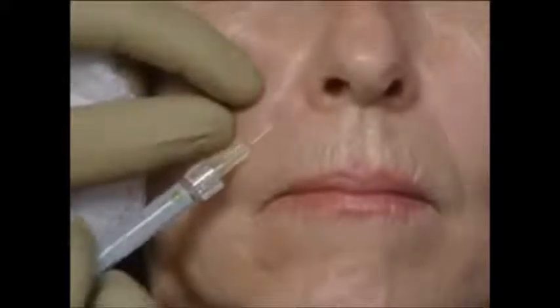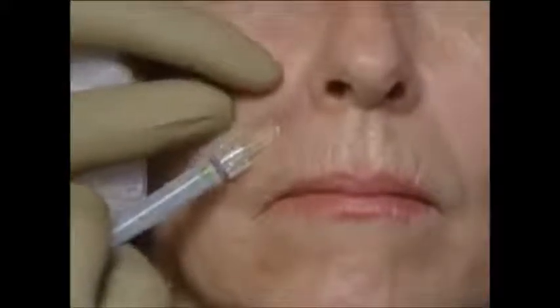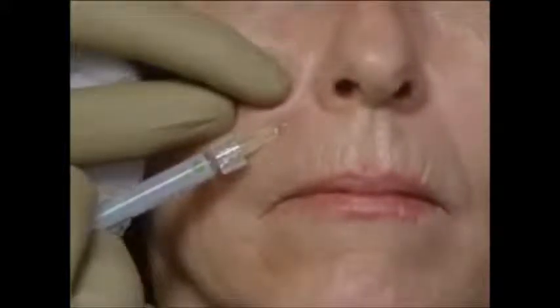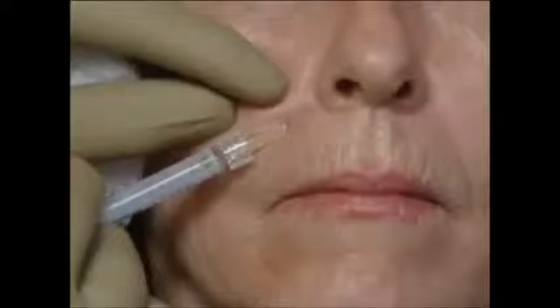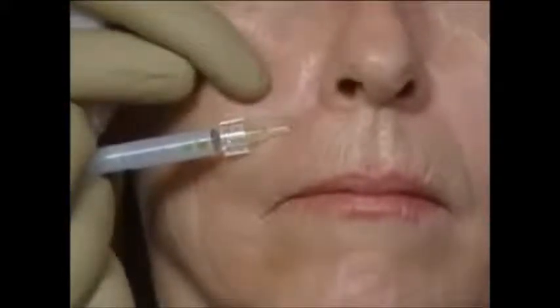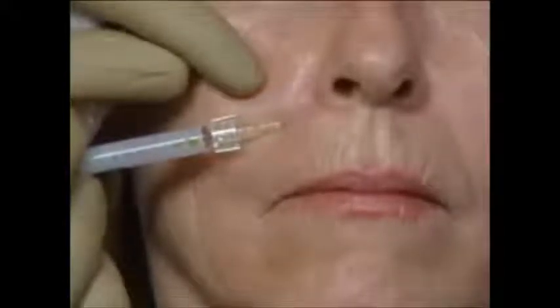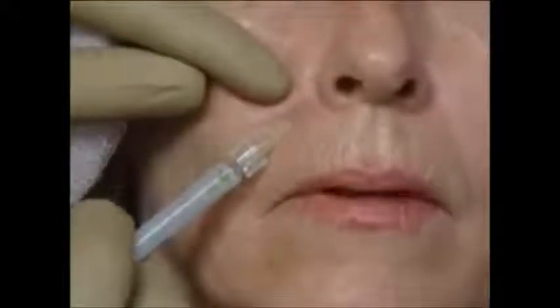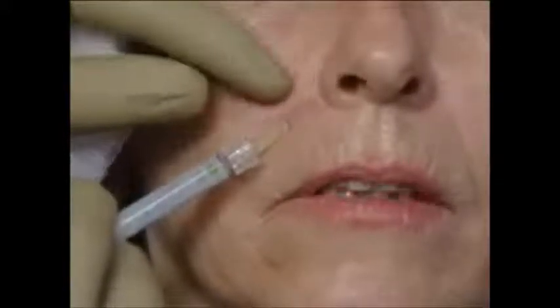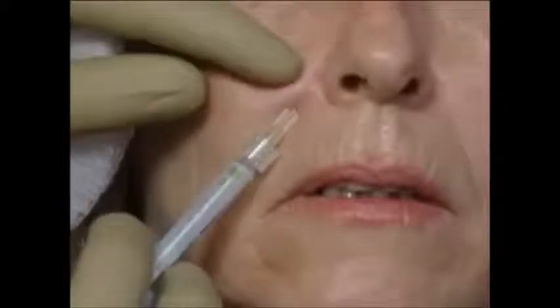Another patient has deep nasolabial folds, type 5, and can be seen here prior to injection. The fanning technique is used again at the alar base, and some of these very deep folds cannot be completely corrected by injection alone. Patients who do not desire surgery should not be overcorrected, as it will provide an unnatural look with too much fullness. The patient can provide feedback as the injection is performed.